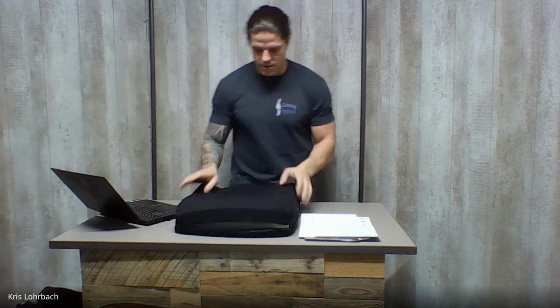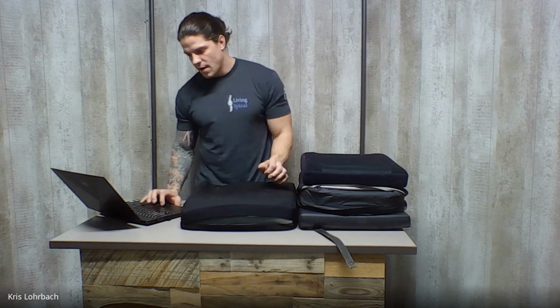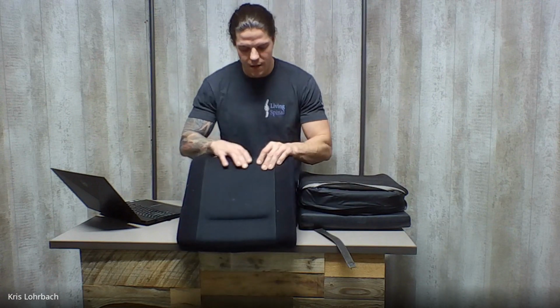The difference between those is the standard stretch covers are usually best for shearing. Remember, we talked about shearing. I can show you right here. This right here is a standard stretch cover. You can feel it wrinkles easily. It stretches very easily. So if my skin goes against that, the material is going to stretch. My skin isn't going to stretch. And then the air exchange cover, which looks something like this. We don't have a great example of an air exchange cover, but it usually looks like a very breathable cover.